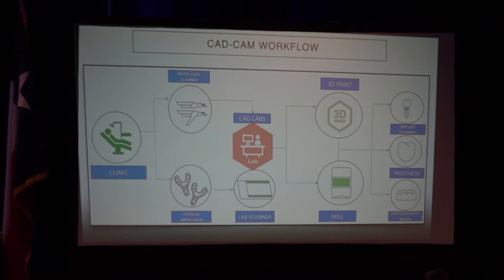As you guys probably know, all zirconia is digitally designed and milled. That's the material science of it. It's milled as a block, and it has a powder, and then it goes into a sintering oven. So there's no custom abutments or anything like that. Nobody's pressing custom abutments. Everything's designed. So it's true that you're in a digital workflow, but it's a hybrid.